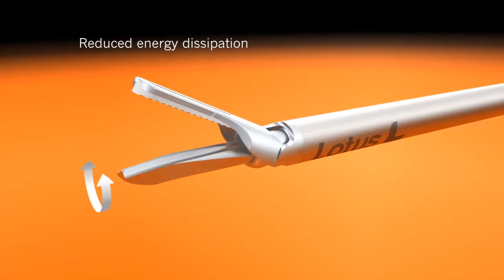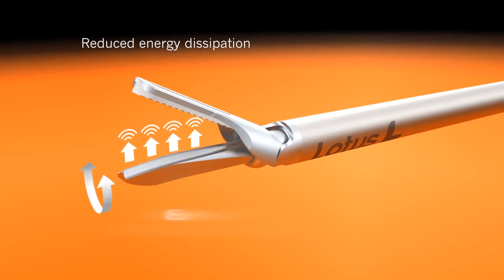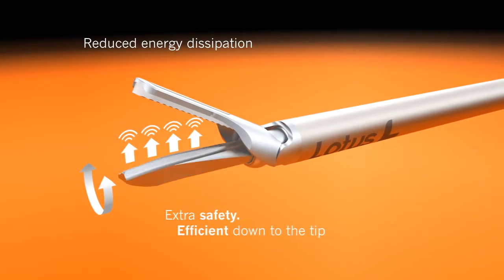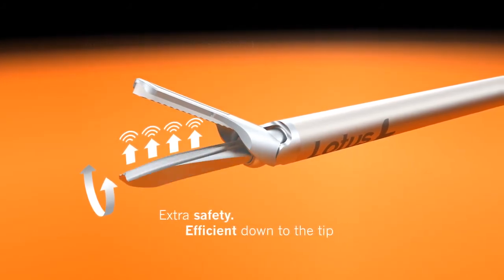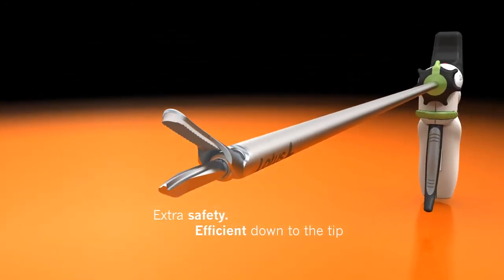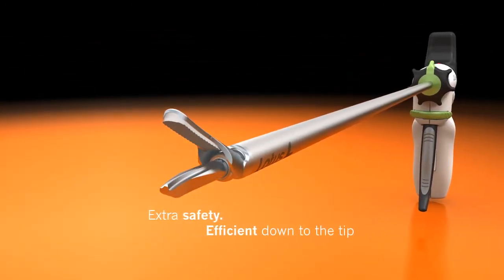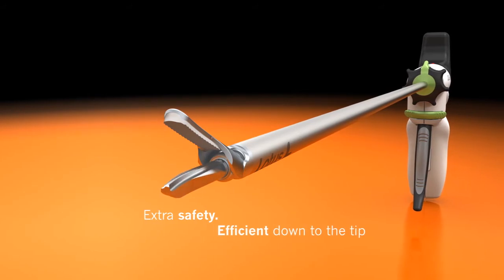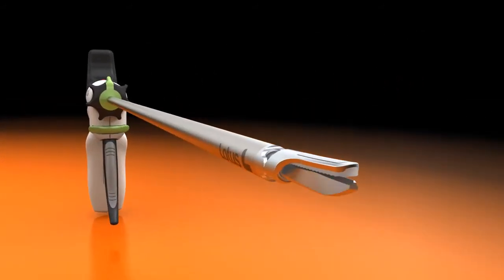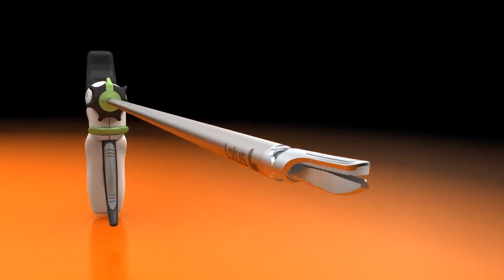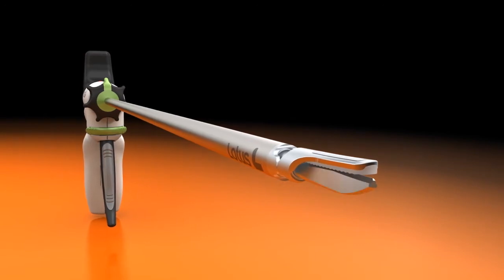The torsional movement of the waveguide reduces energy dissipation compared with conventional instruments. Blood vessels can be sealed quickly and securely with the Lotus ultrasonic scalpel. The patented torsional ultrasonic technology makes the Lotus system particularly efficient.